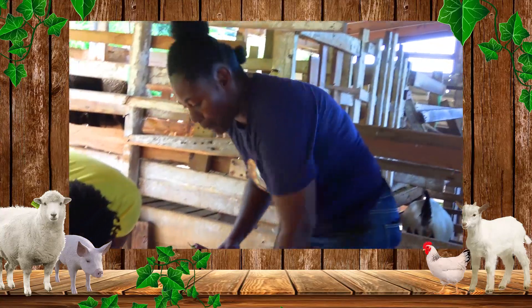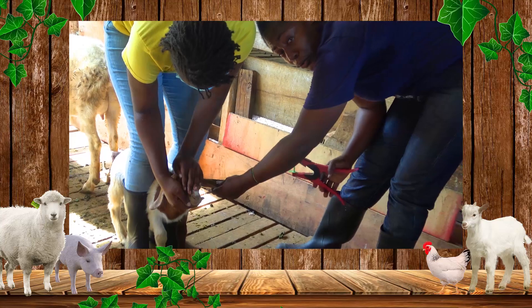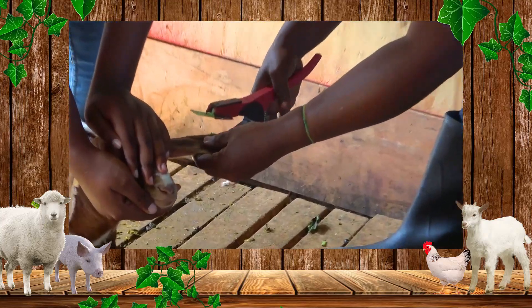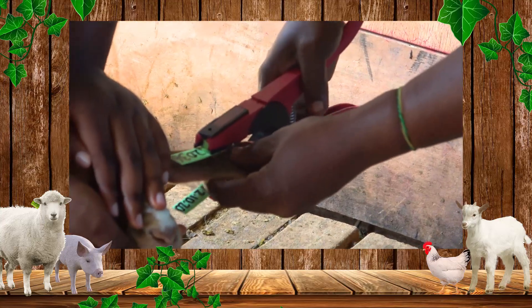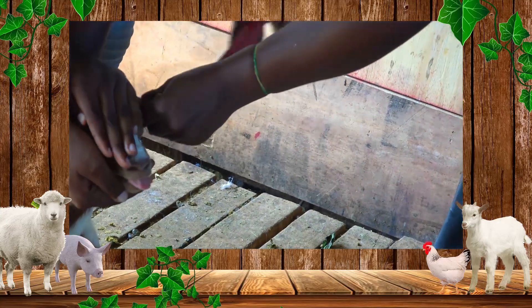With a quick action when you are going to apply the tag, you find the main veins and you try not to bore the veins, so you go between the two veins. Then with a quick action you press down and release.